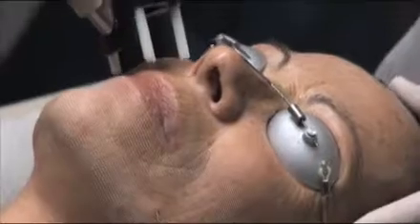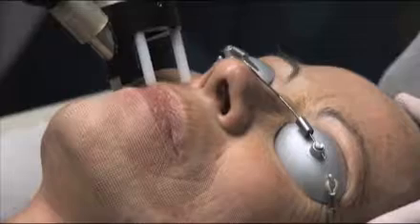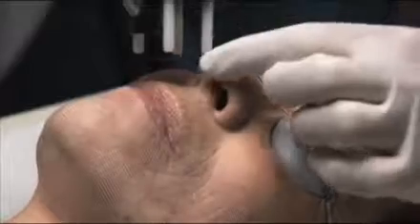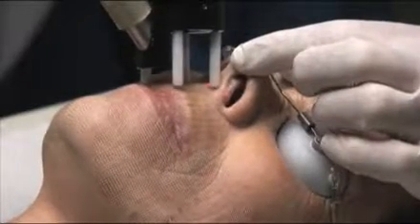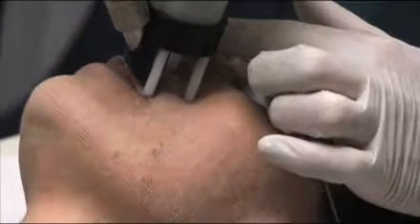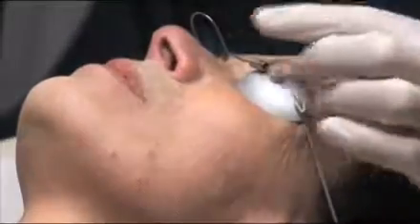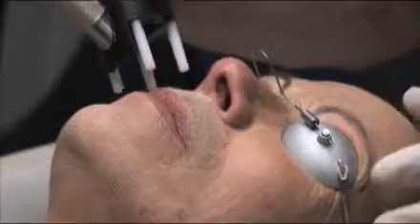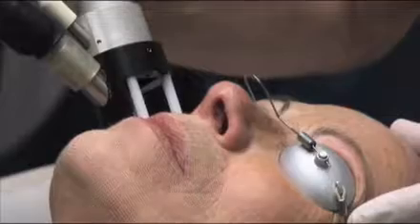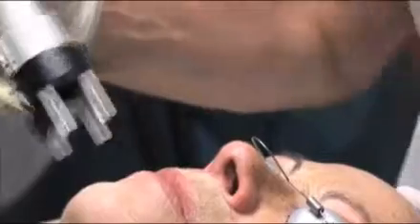I've just gone over the upper lip, which is often a more sensitive area. On the lip, small wrinkles are slightly more pronounced. We can therefore do a second passage. We do not treat the red lip, white lip junction. And we will finish by treating the lower part of the face.